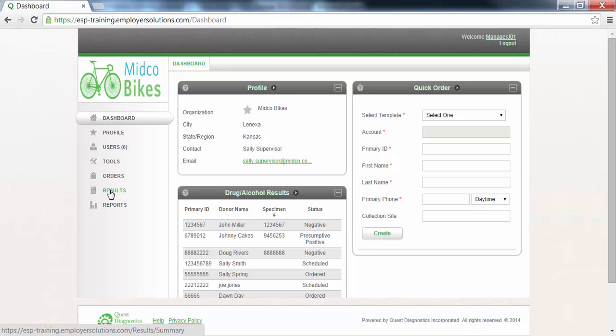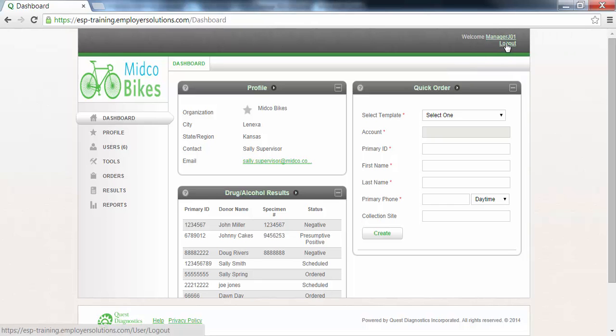The enter alcohol result function in ESP allows you to manage your own breath alcohol testing program and record results for viewing in the future. This completes the Employer Solutions Portal online tutorial.